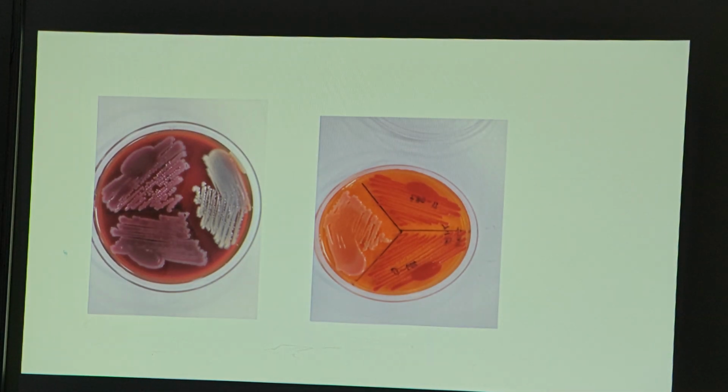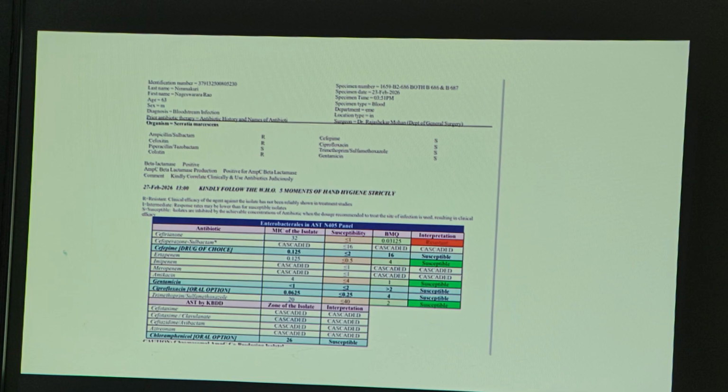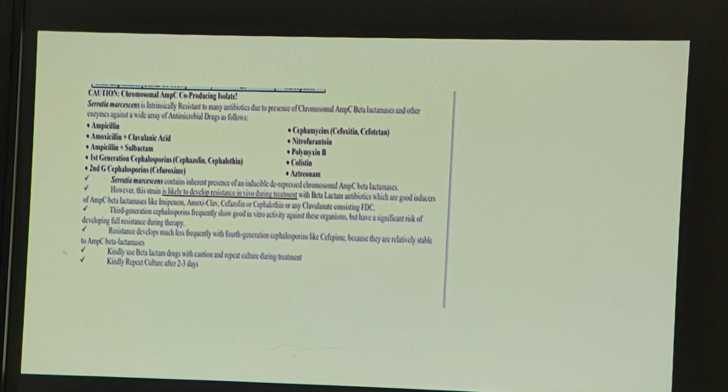So the Serratia from blood, maybe it's a case of urosepsis, we are thinking, because the patient is having diabetes mellitus and clinical features of UTI for 1 week. Maybe the source of infection may be the urinary tract. So this is our report. We clearly mentioned the SPICE organism, that giving amoxiclav, imipenem-like combinations induces intrinsic resistance, everything we mentioned in this culture report. So this is all about the 4 cases.